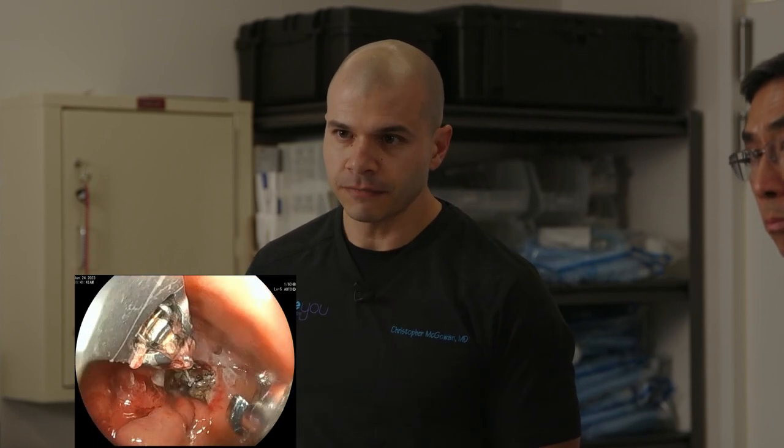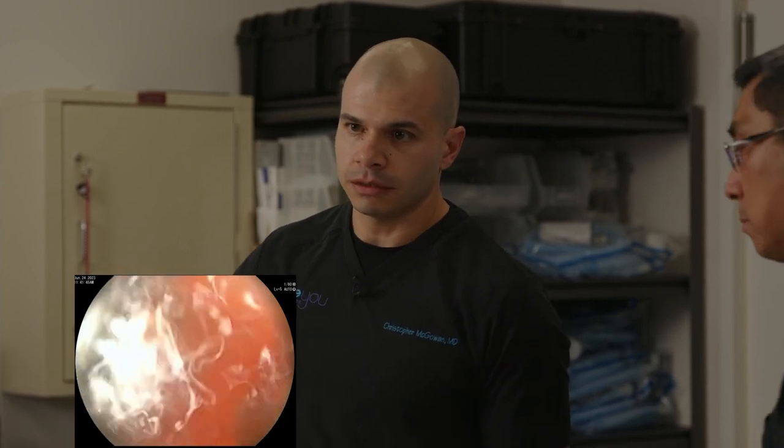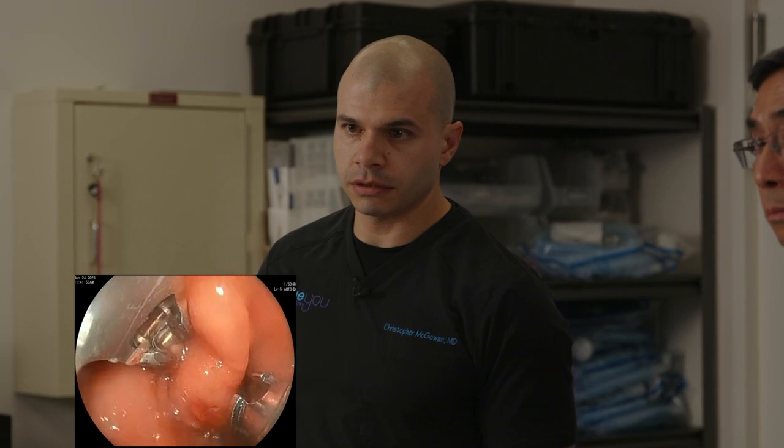So again, you can see our little outlet in the distance and our gastroplasty here, so that pouch is much smaller. I plan for one more suture here. It's looking pretty snug. So we may actually conclude this procedure right here. I'd like to defer to Roche on these matters.